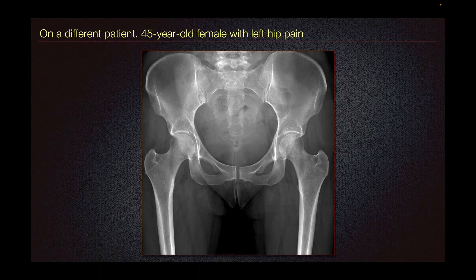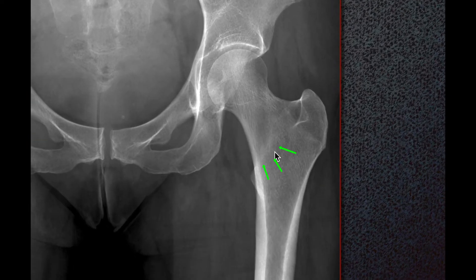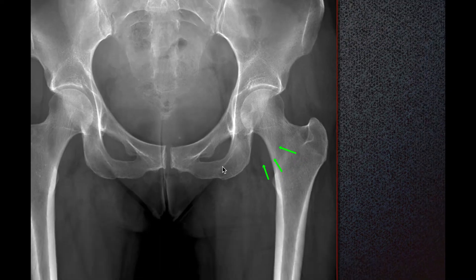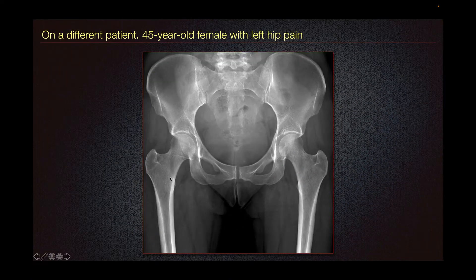As in this 45-year-old female with left hip pain, although radiograph is insensitive and can be normal in most cases, this patient shows a band of sclerosis in the left femoral neck compared to the normal side on the right, where you don't see a sclerotic band. This is concerning for stress fracture.